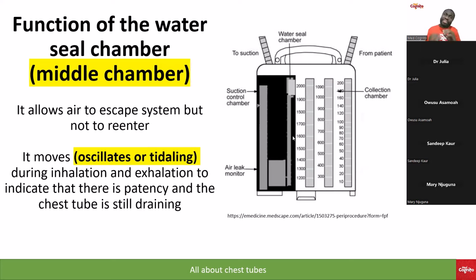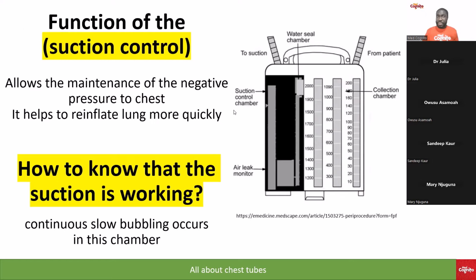Okay. Another thing you also need to know for your NCLEX exam is that that water chamber oscillates. When we say oscillate, it moves up and down as the patient is breathing in. And when it moves up and down like that, it helps me to know that the patient is breathing. As soon as that movement stops, there may be a problem.